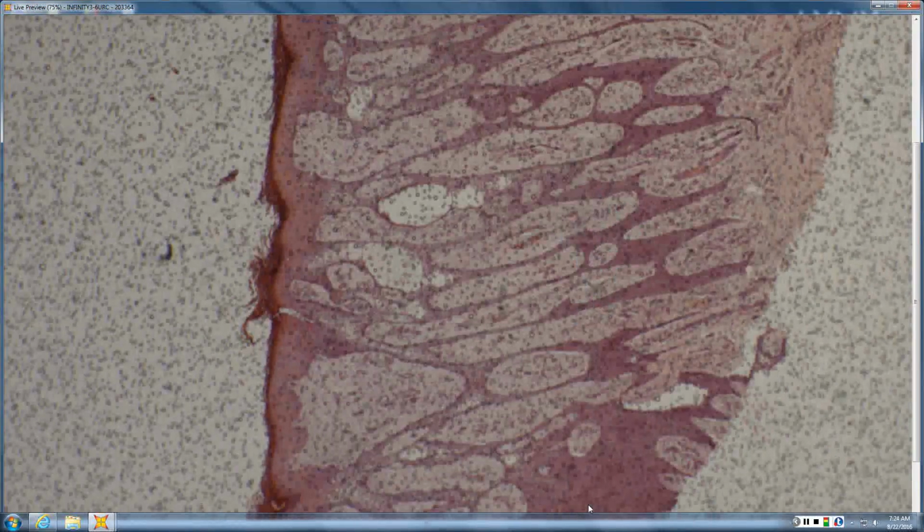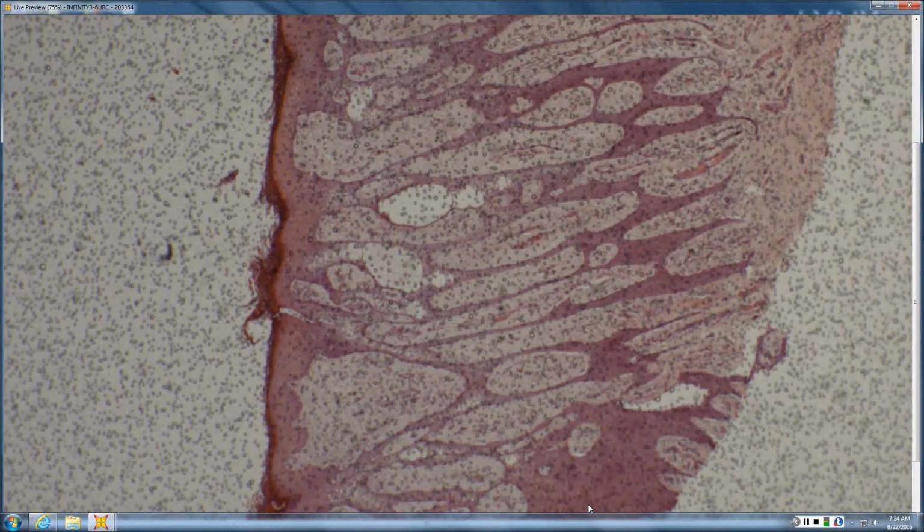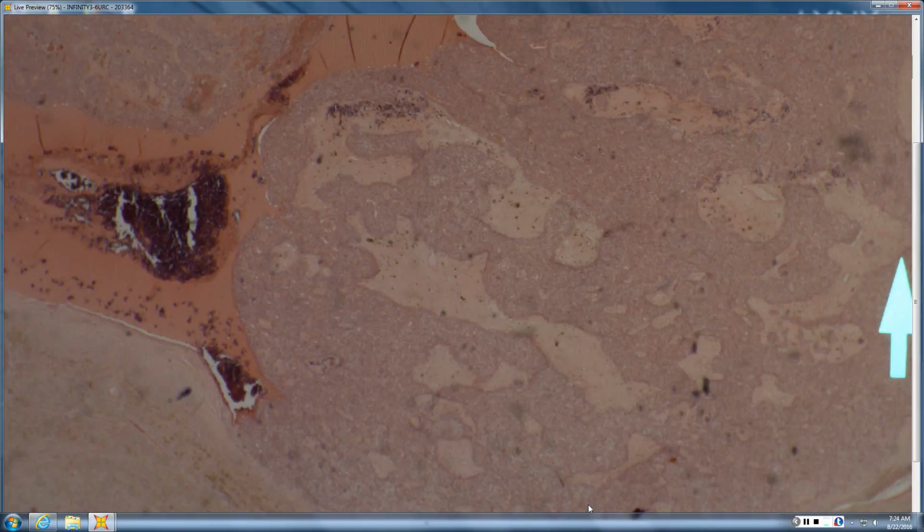And thinking of things that look similar, in a certain sense, you could almost be like, oh, is this Pinkus tumor? But it's not, because you don't really have the thin, pink strands and blue buds. It's more just these thin strands coming off the epidermis, usually very vertically oriented. And you might even see little ducts here and there occasionally.